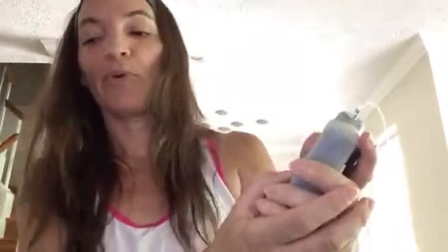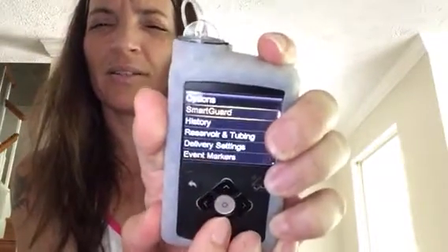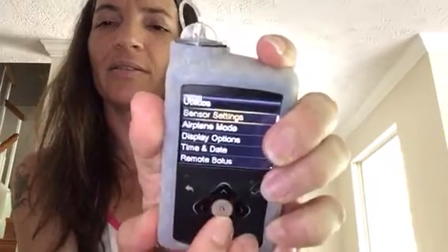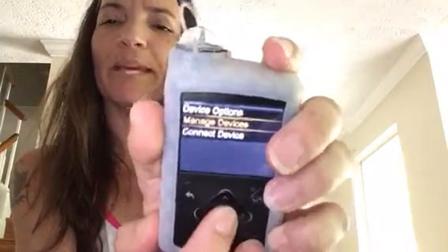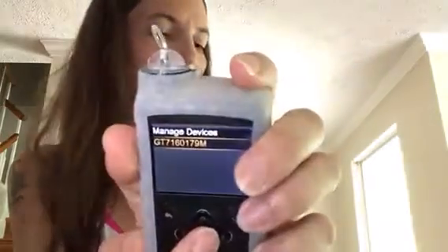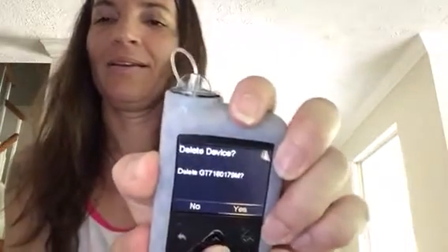The next thing I need to do is delete both my transmitter and my meter from my pump. I'm gonna go into my menu, go down to Options, go down to Utilities, Device Options, and Manage Devices. My meter wasn't on there — because I just deleted it. I'm going to delete my GT number; my meter was a BG number and my sensor is a GT number. I'm gonna select it and delete it.